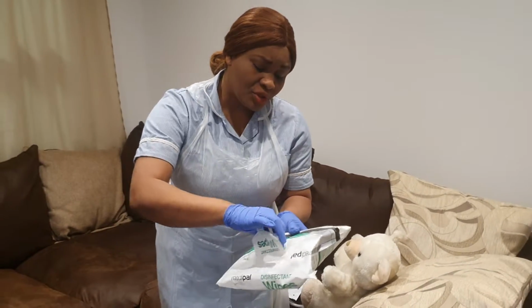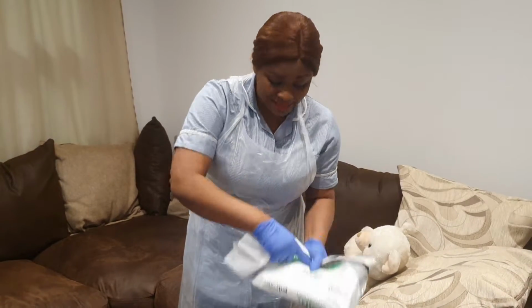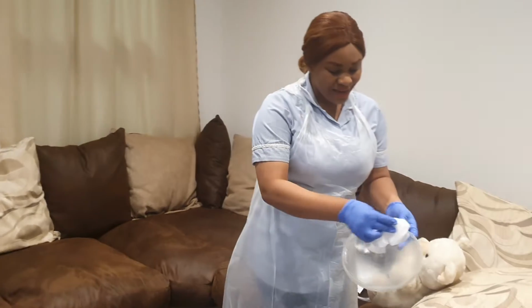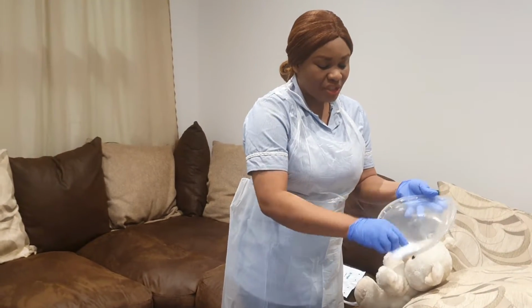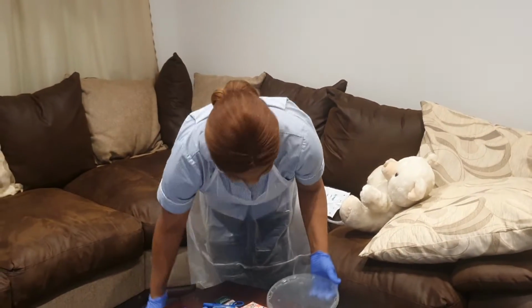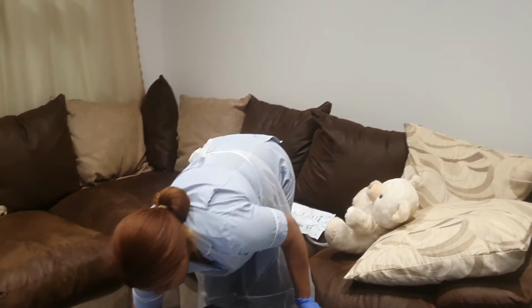All right. So I'm just going to pick my cleaner wipes and I'll clean my tray in a zigzag manner from the farthest point to the nearest point. All right, guys. So I'm cleaning my tray in a zigzag manner. After which, guys, this goes in the clinical waste. So my tray is clean.